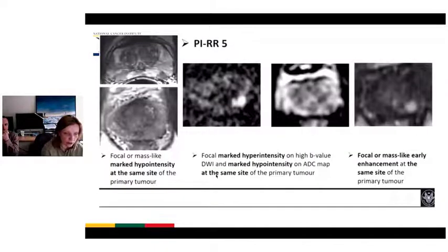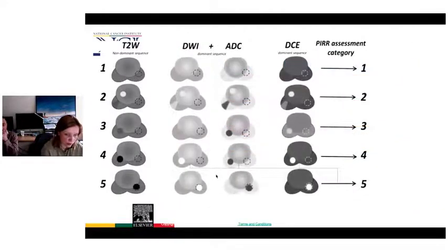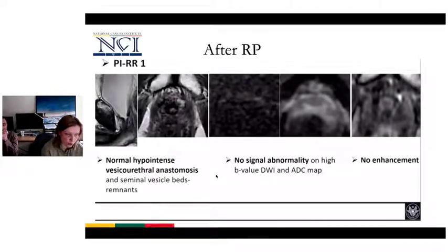It's not included in the last version of PI-RADS 2.1, but you are welcome to know about these new papers.